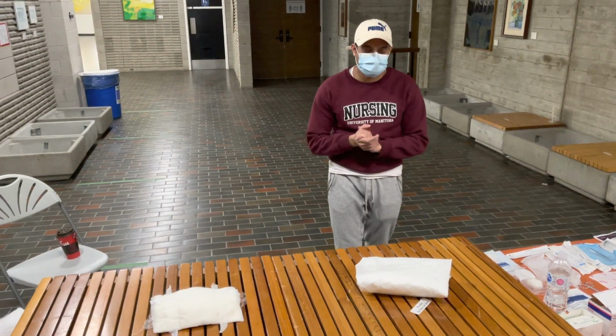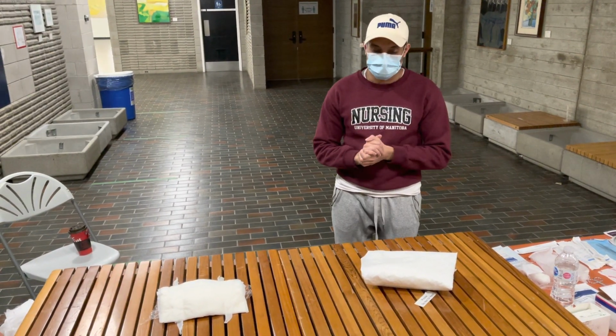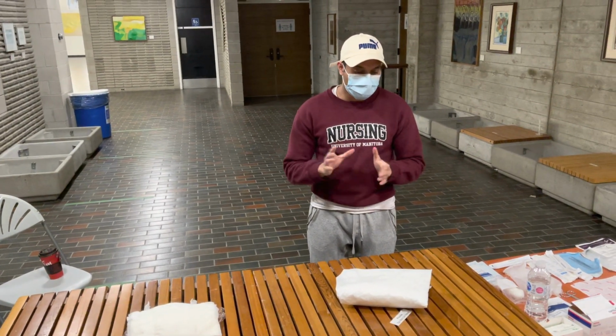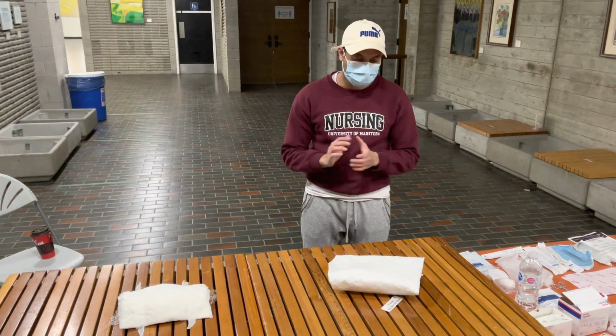My name is Alper. I'm a student nurse at the UC Manitoba. Today we're going to be demonstrating a complex wound dressing. So we have our supplies here. We also read the physician's order, and we have a wound care due for today. So we're just going to be doing that.